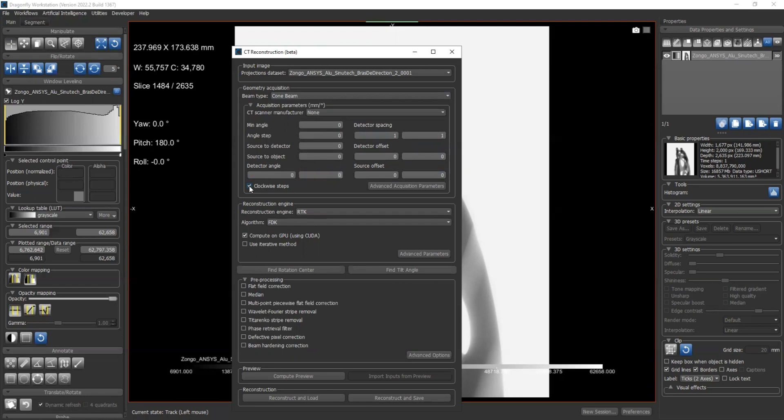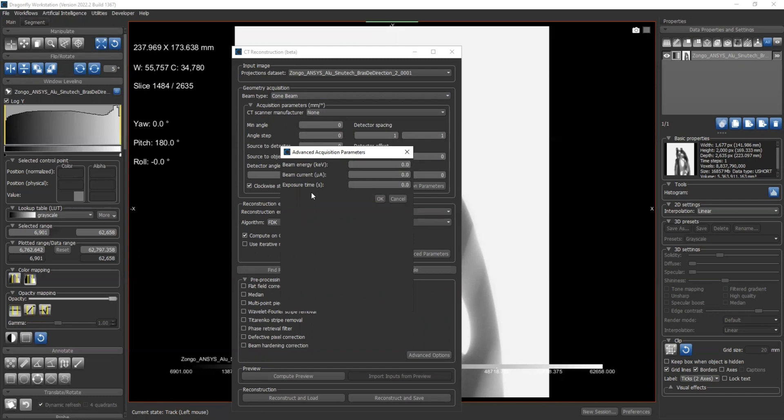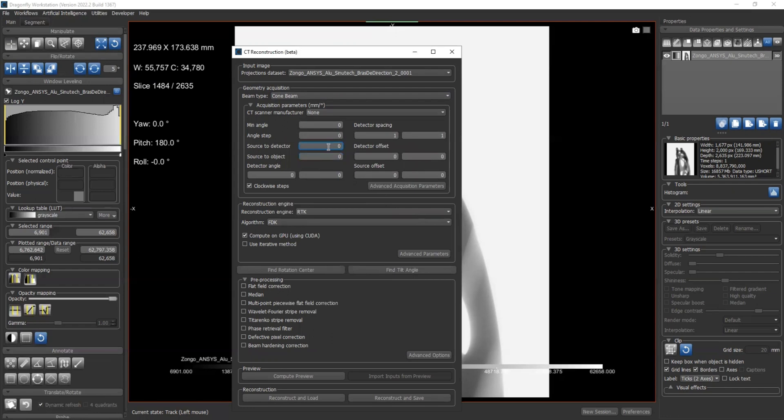Besides, we have clockwise steps. If you check it, the rotation direction is clockwise. Otherwise, if you uncheck it, it's counterclockwise. For the advanced acquisition parameters, we have energy, beam energy, beam current, and exposure time. For now, we don't use those parameters, but in the future they may be useful.